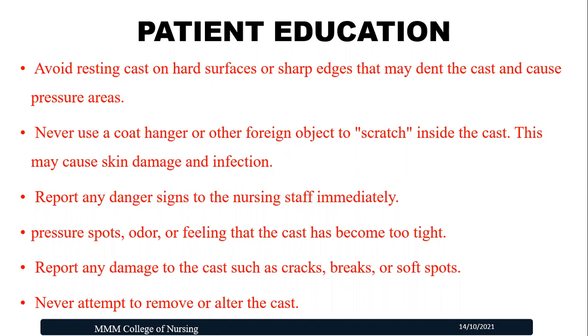Many times, patients wearing the cast will feel itchy sensations inside the part of the body over which the cast is applied. So the patients have the intention of scratching the area using a pencil or coat hanger or comb or pen, something which is weak, which can be used, but that can be avoided. We need to teach the patient not to scratch inside the cast, because when we scratch, there can be skin breakdown, which can cause pressure ulcers.